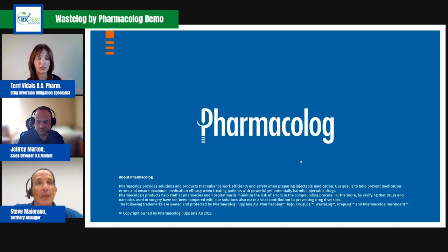If it's not Codonics and it's not a major brand from a manufacturer, how does that work? Who puts that formulary in? It would come from when the pharmacy gets a new manufactured item in from a different manufacturer. That information would have to go into their system. Okay. And then that system transfers over to us.